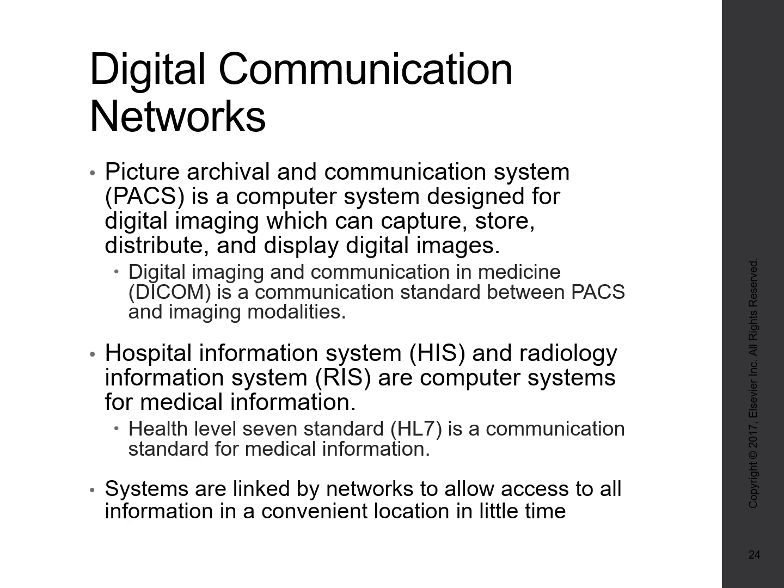So the system that you hear about most frequently would be PACS. PACS is Picture Archival and Communication System. So every time that you're in an imaging site and you save an image and send it to the radiologist, what it's doing is it's going to a PACS system, which is a storage system.